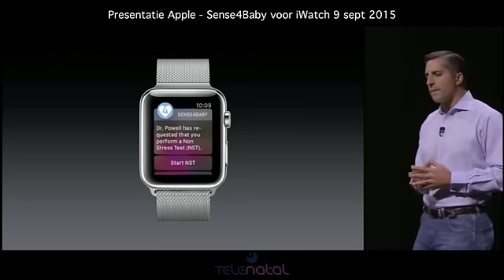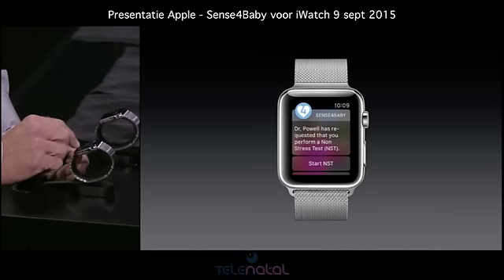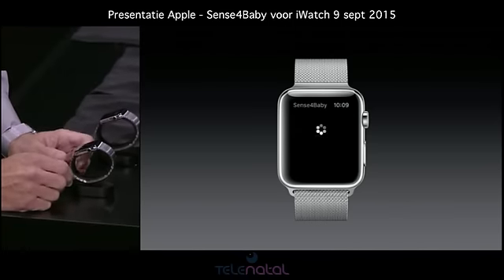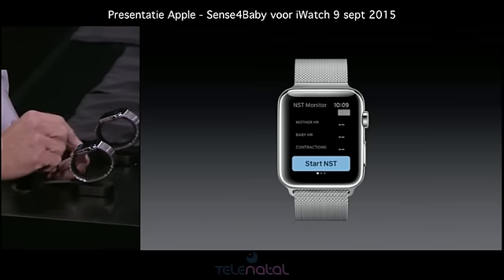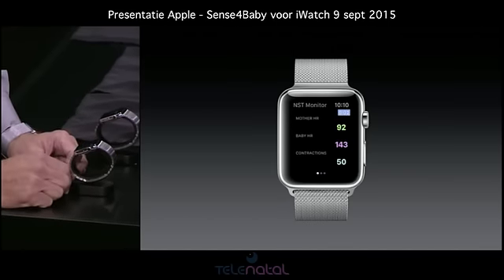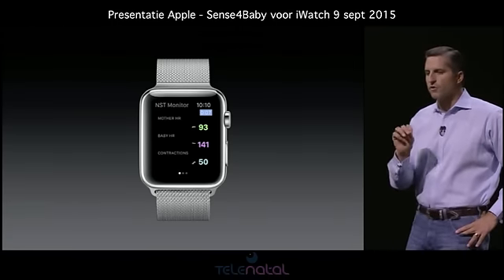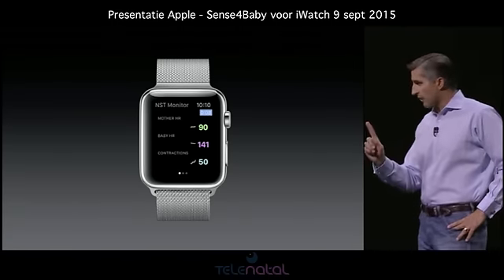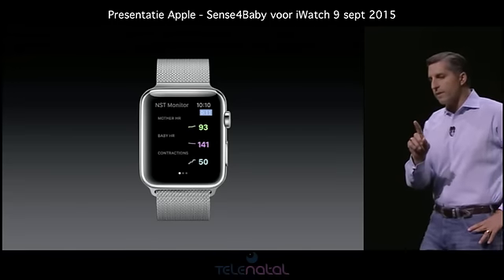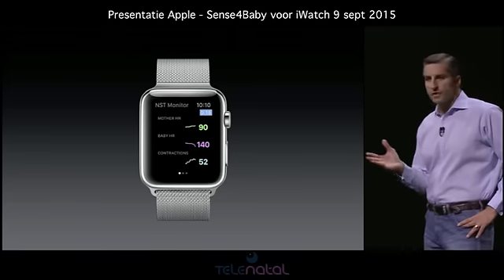So here you see a message from a doctor to the pregnant patient at home asking her to begin monitoring her baby's heart with something called the non-stress test, or an NST. Now the mom, with the watch on her wrist and connected to the Sense4Baby sensors on her belly, starts the test. Now, as I can see on this green line, I can confirm that I'm monitoring the mother's heart rate as it's being read by Apple Watch. But I can also see the baby's heart rate and the mother's contractions as they're being read from Sense4Baby.